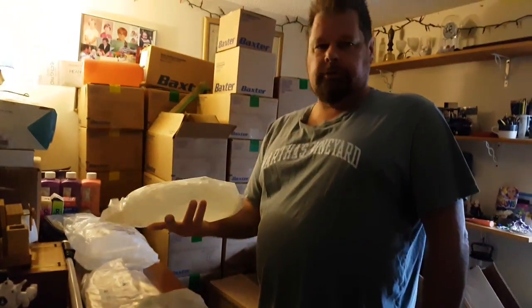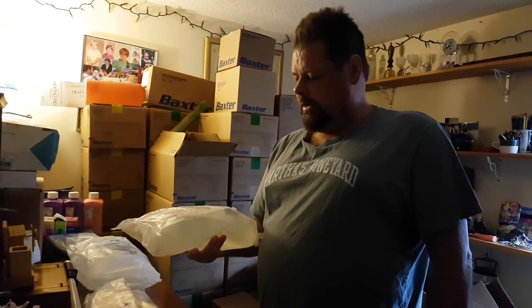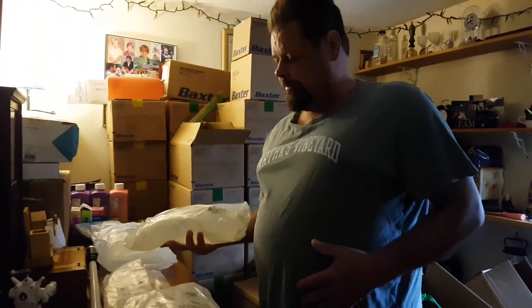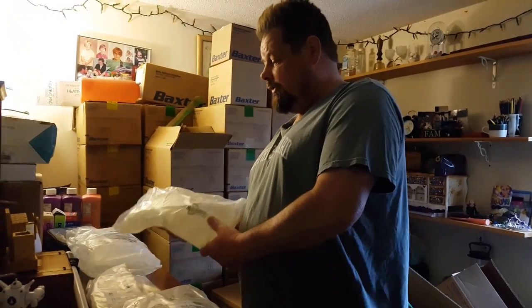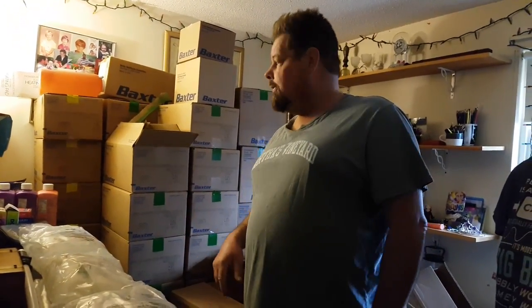So I have this in my stomach right now, sitting here all day. So it's basically a lot of extra weight and pressure on my back. So it's pretty much like a baby, unfortunately. So when you start at night, that's kind of the first fluid that's draining out. What's been in your body all day drains out before it refills. Right.